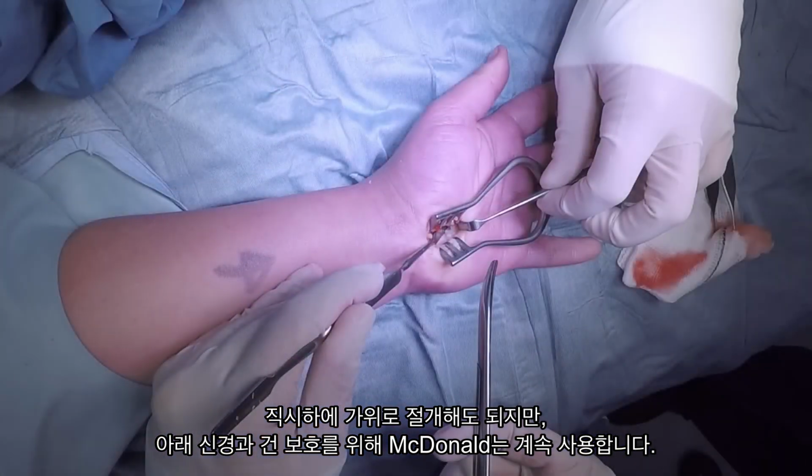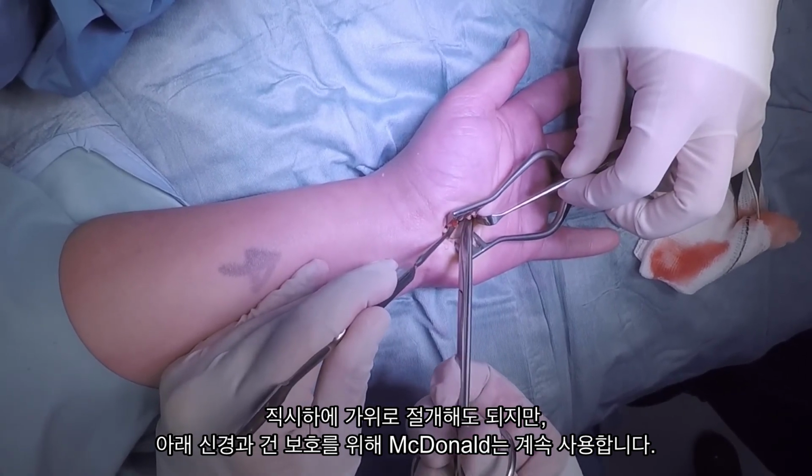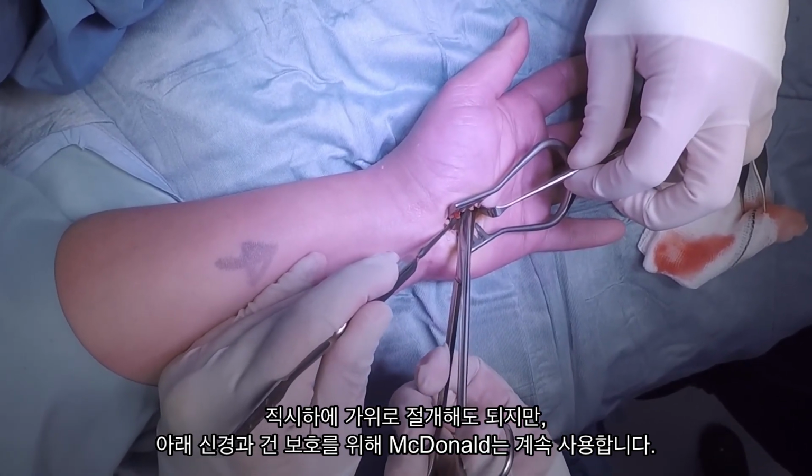Alternatively, you can use your dissecting scissors to divide the ligament under direct vision instead of the blade, but you still should use your McDonald to protect the nerve and tendons underneath. The ligament is quite thick, and often as you divide it completely, you feel a give, which you can see here.